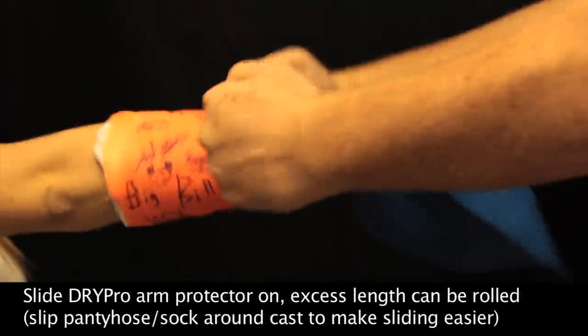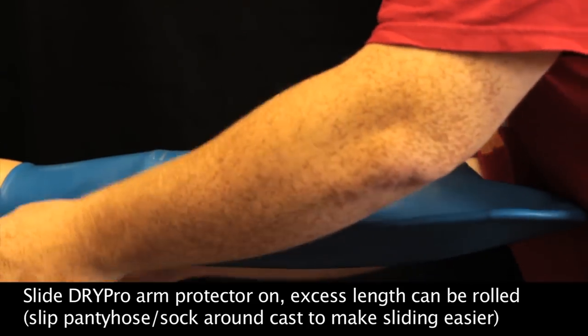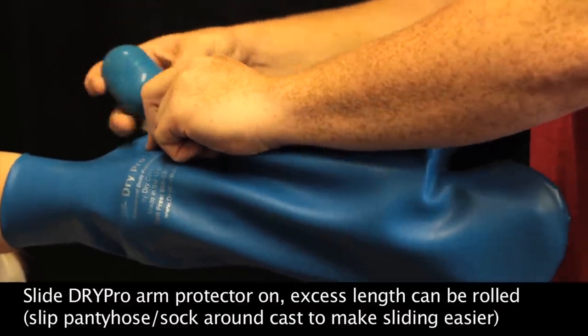Now you're ready to slide the DryPro arm protector on, which may be made easier by either putting a sock or pantyhose around the cast. There may be some excess length at the top, in which case you are able to roll this on itself, which still allows for the vacuum seal to set.